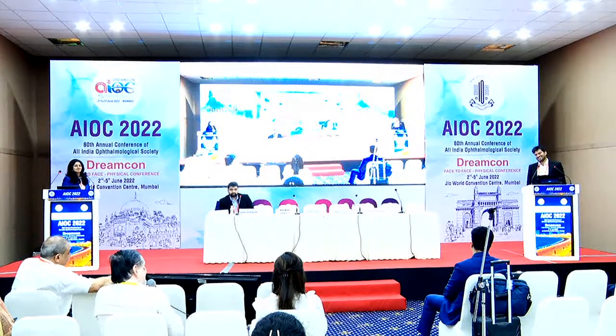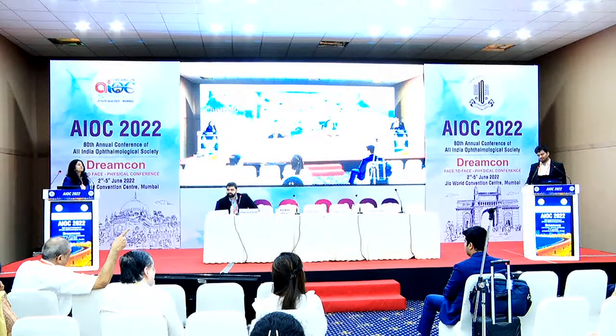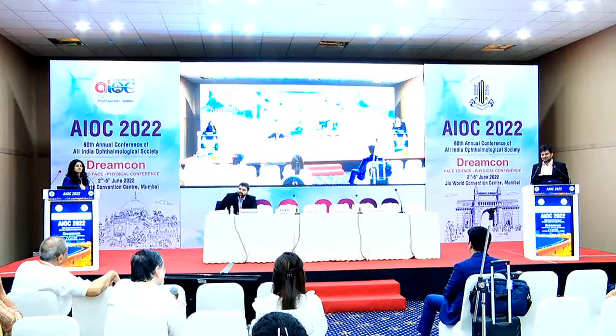Your surgery was very good, everything was okay, but the only thing is nowadays the trifocal lenses are supposed to give less glare than bifocal. True, sir, yes. Not available, correct, sir. This was some time back, so I could do it, sir. Short supply, right, sir. Very good surgery. Yes, thank you, sir, thank you.